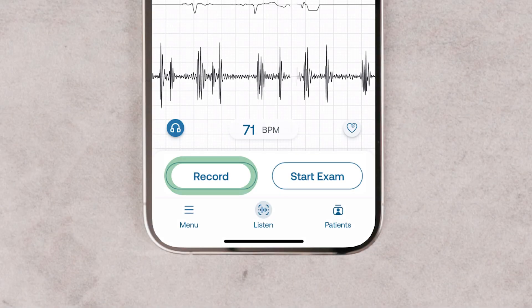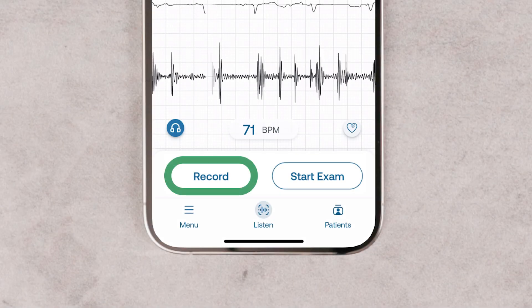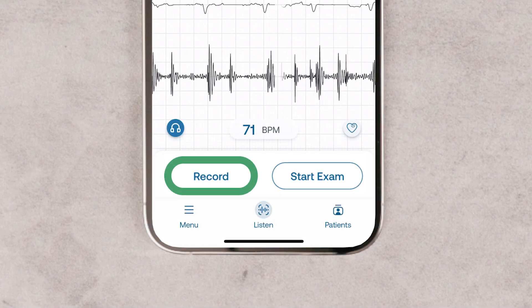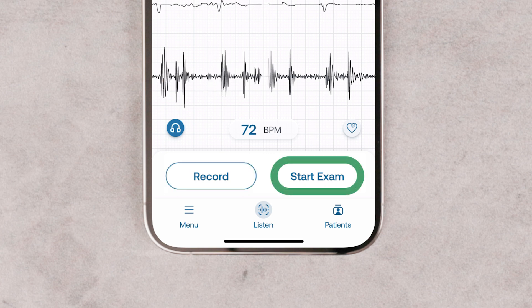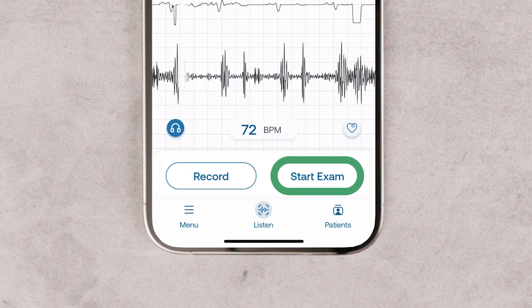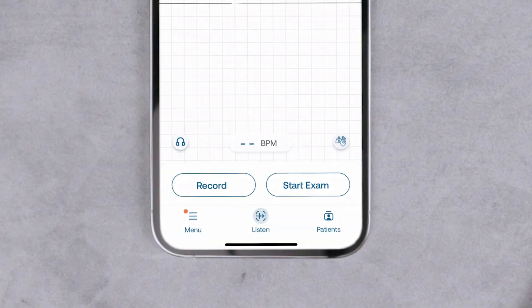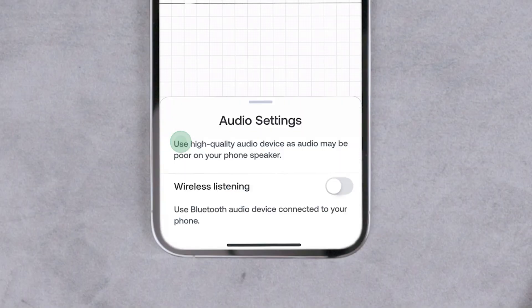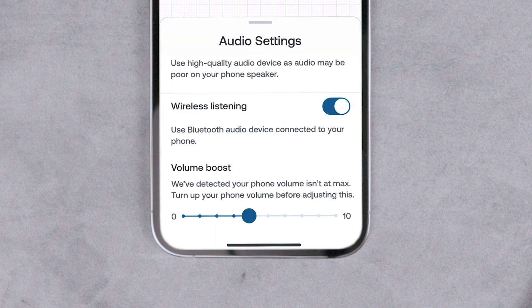You can start a single recording for a range of body sounds or take a guided four-point cardiac exam. Tap the headphones icon to start wireless listening. In audio settings, turn on wireless listening. This lets you play sound from headphones or hearing aids.